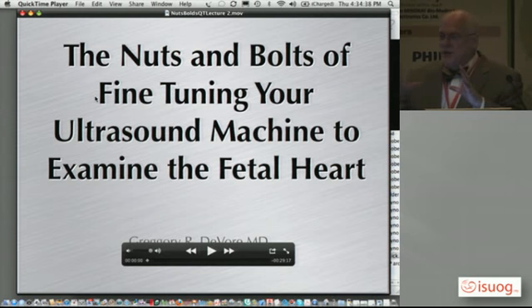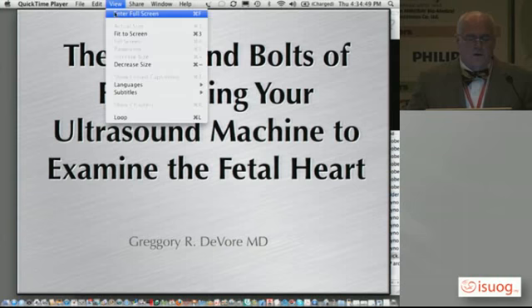I'm going to take you through this step by step on how to optimize the machine. There's going to be lots of information. I hope you don't fall asleep. I'll check you when we finish to see if you're sleeping. But pay attention and see what you can find. Okay, so here we go. Let's begin the movie and see how it goes.